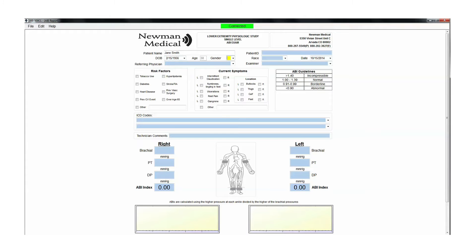Take the relevant patient history, including patient information, risk factors, current symptoms, ICD codes, etc.